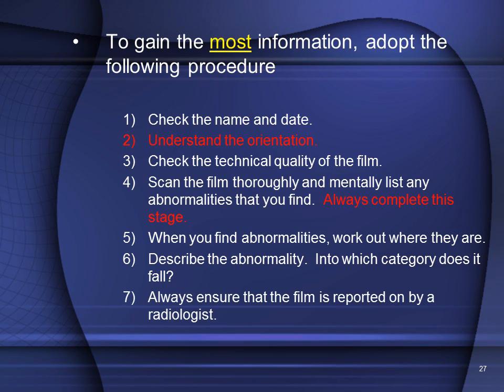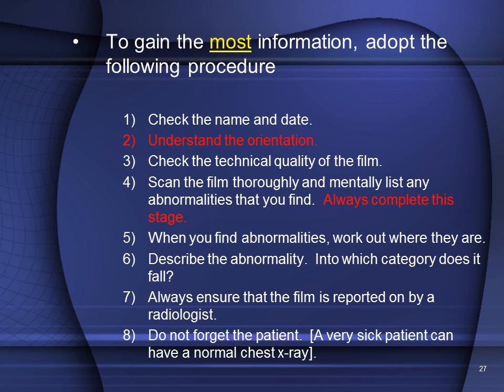Always ensure that the film you are looking at is reported on by a radiologist. And lastly, never forget the patient. A very sick patient can have a normal chest X-ray.